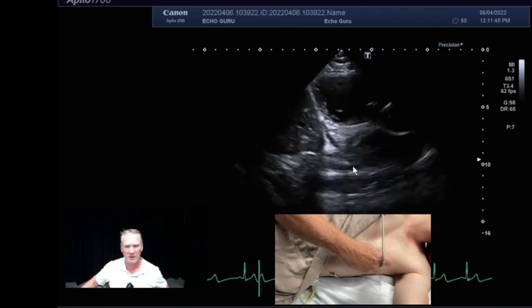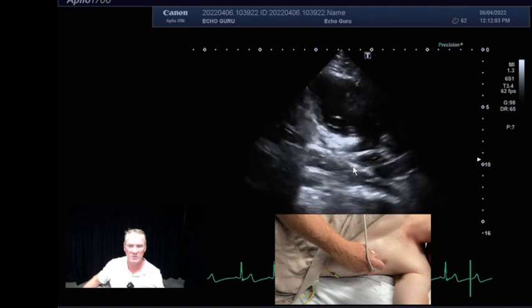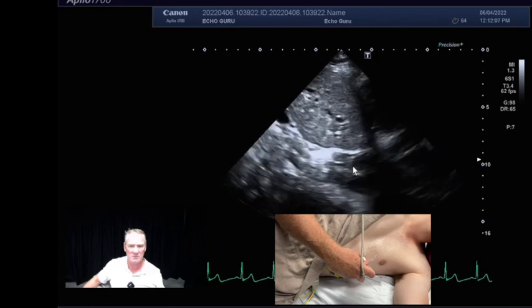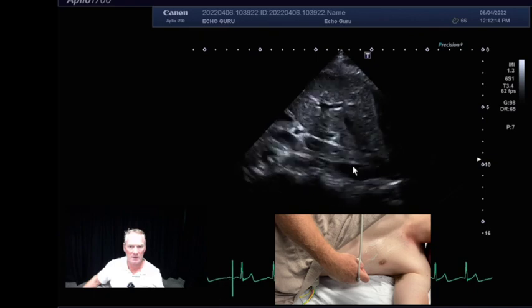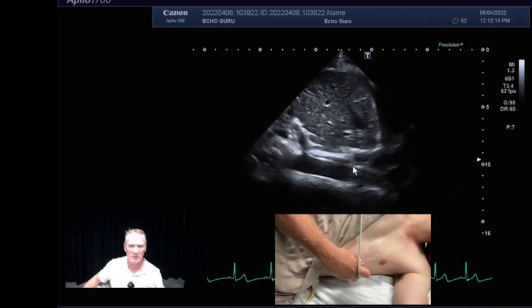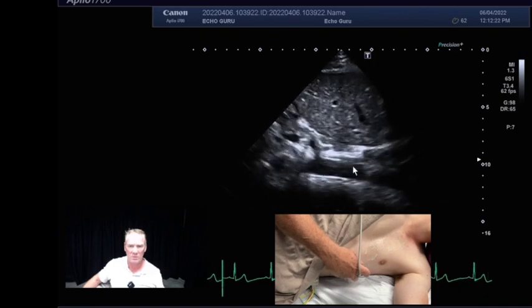Till we go below the diaphragm. Going below the diaphragm, it's sort of almost like a two-chamber view through here. And as I'm moving along, as I'm sliding, I'm sort of also rotating as well to keep that opened up. There's the IVC. Here's the abdominal aorta. You can see it's pulsatile. It's got much thicker walls than the IVC.